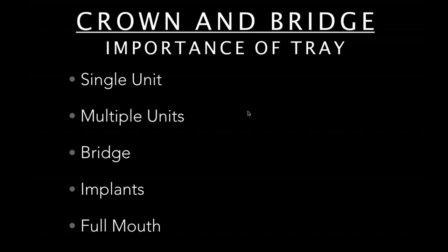So let's take a look at different situations in crown and bridge. We have single units, multiple units, bridge, implants, and full mouth. We're going to talk about those a little bit. So one of the questions that came in is, do I believe in triple trays? I do. A lot of people, if you do a little research and look up Power Bite, I do like triple trays for single units or 2 units, and also for second molars.